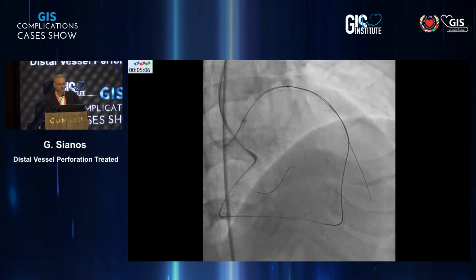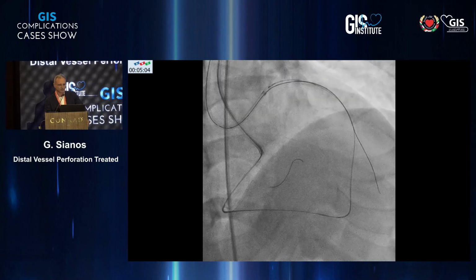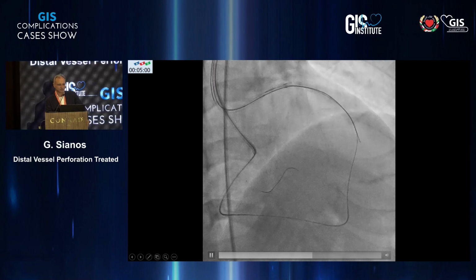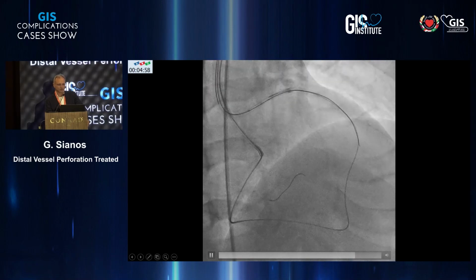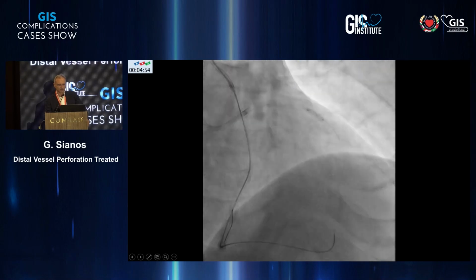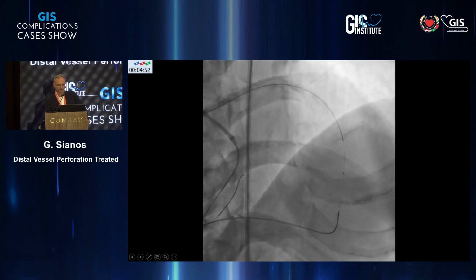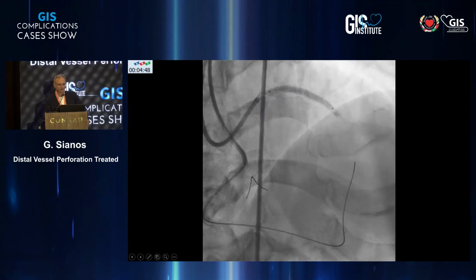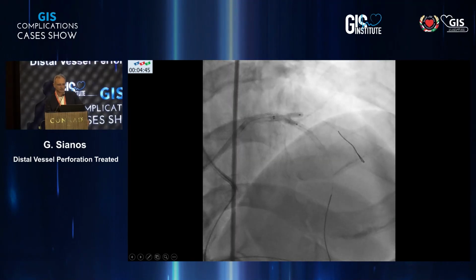And it goes into the guiding catheter extension, it goes into the other guiding. The wire was externalized, and then the guiding was advanced, no problem to cross retrogradely the stent, and then after externalization of wire, pre-dilatation, and a stent was placed after IVUS control, and kissing balloon over this.